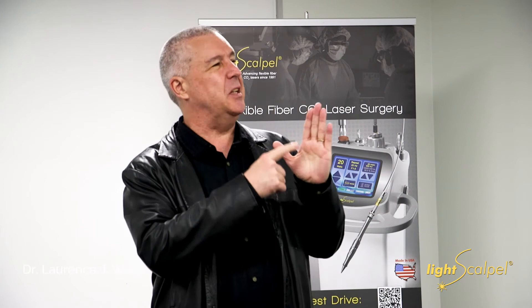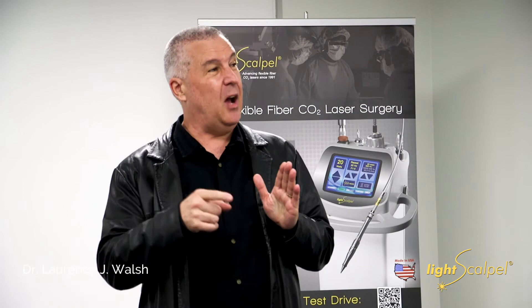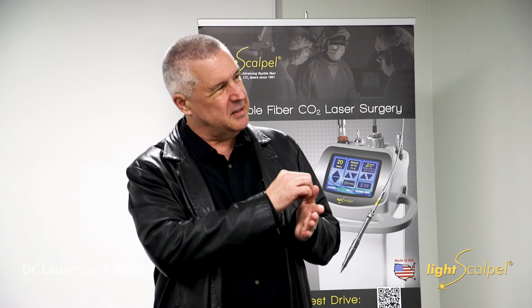It's very different to charring from a diode versus charring from CO2 — the depth of penetration is very different. With a diode using a thermal camera, you can see the tip, once initiated, is running between 800 and 2,000 degrees. I've got pictures of an orthodontic trainee pushing the glass tip of the diode against enamel and melting the enamel surface — that takes 2,000 degrees. That's how a diode actually works — it's boiling the cells as it goes through the tissue. With the CO2, the tissue is just erasing in front of the beam without contact. That also means less bacteraemia because you're not physically touching the tissue at all — it's almost a totally hands-off procedure.